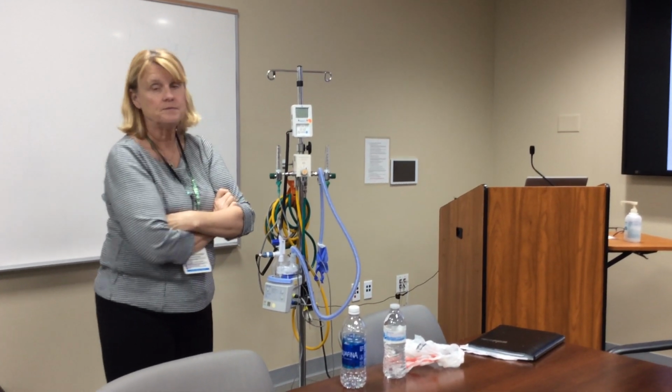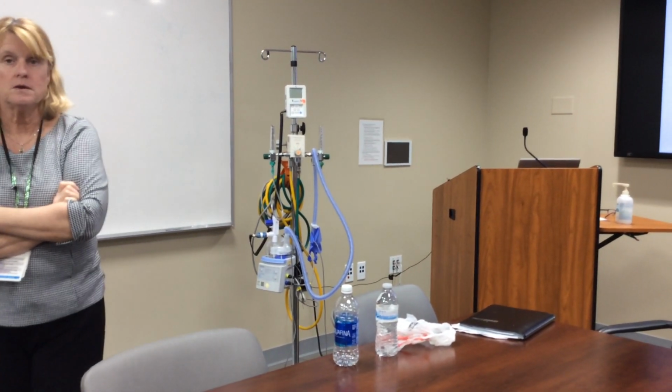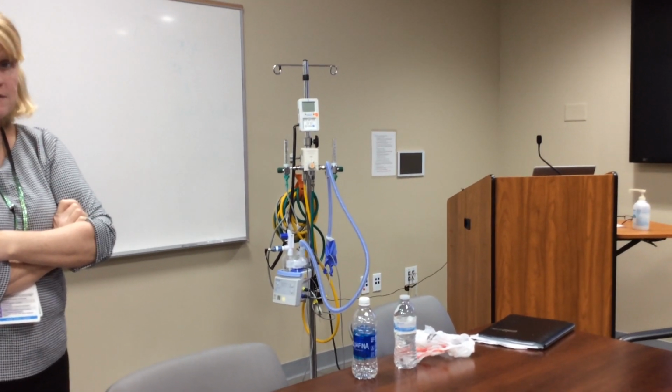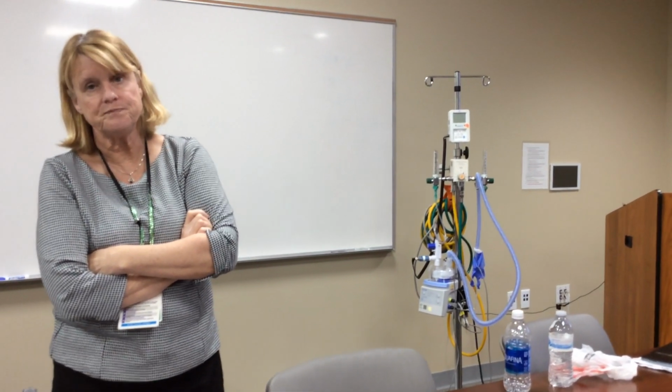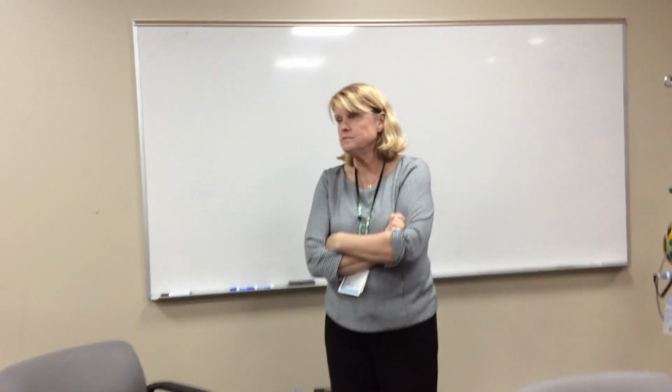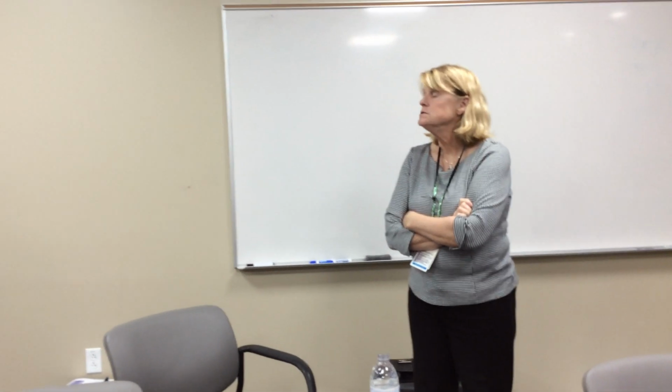So do you want to go up on the liter flow before you go up on the FiO2? Yes. If you're at 50% already, which you should be, that's what you do, go up on the liter flow. Or is there an indication for patients who might need a lesser oxygen concentration that you could start the flow but start the FiO2 lower? That's the reason for a protocol. You always start at 50%, and then, yes, you can go down, but remember we said we don't wean in the ED.